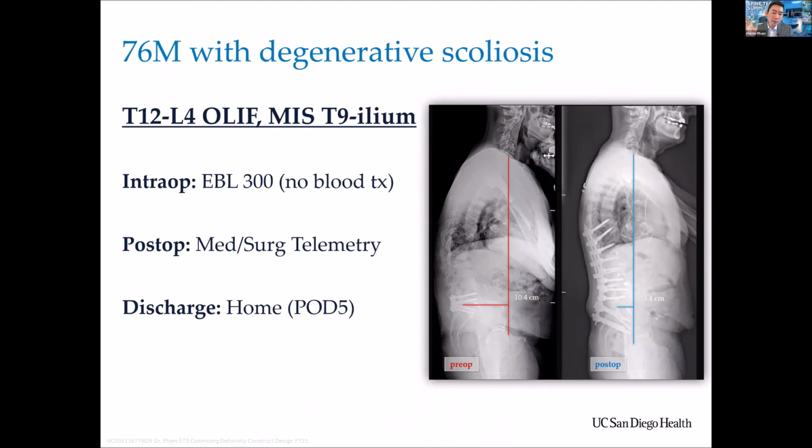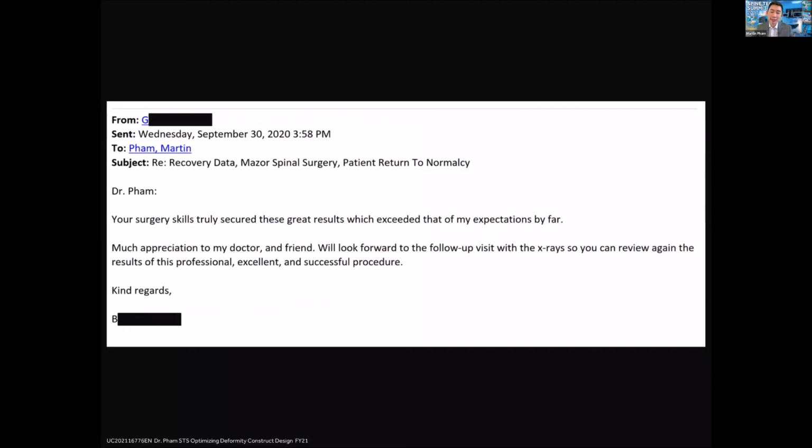He went right to med-surg, walked on the first day after surgery. He was sitting and walking, and went home on the 5th day. So again, he sent me a really nice email, really complimentary to how good his outcome was. And with as good of an outcome as this, I couldn't ask for better than this.